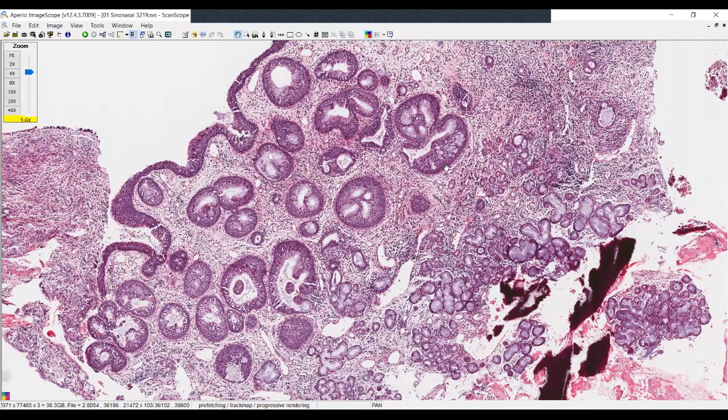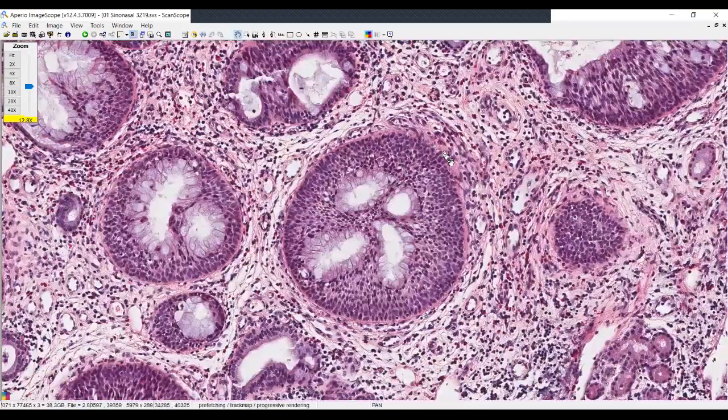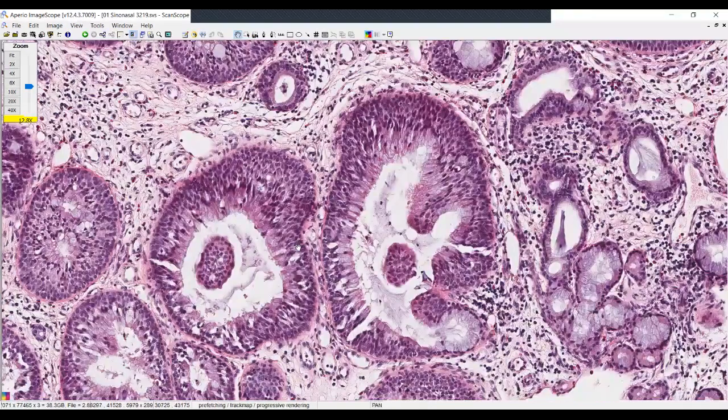And as I look at it, I think, wow, there's something a little bit more going on here. First of all, there is an overlying respiratory epithelial component, and then these are very well-developed spaces that are dilated below the stroma. And even as I go to slightly intermediate power, I think that you can tell there is a remarkably intact and well-developed basement membrane type material here. That basement membrane material is containing each of these little islands of epithelium, even though clearly they seem to be somewhat proliferative or hyperplastic in overall appearance.